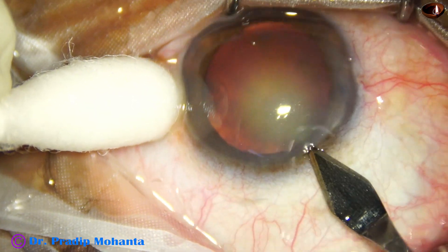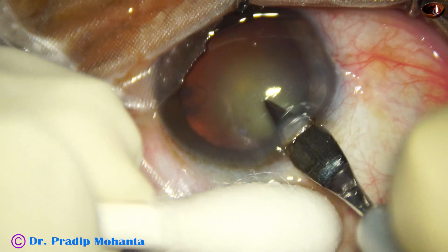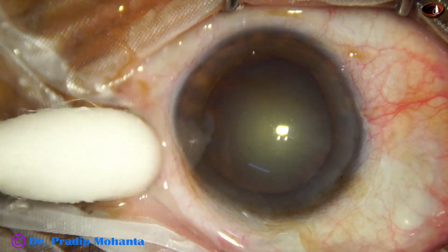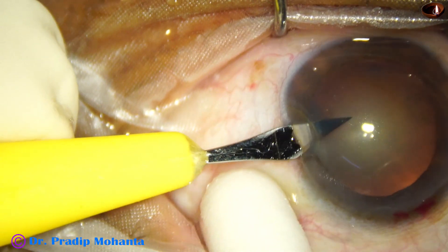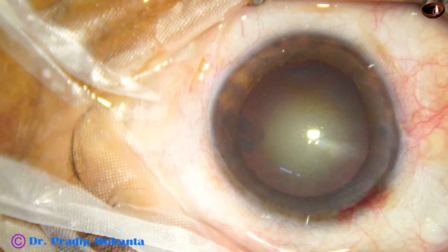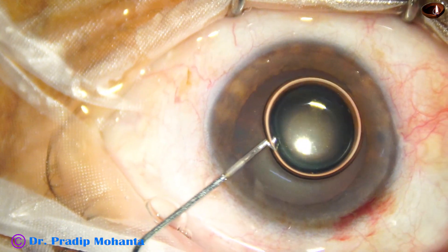This is the main incision with a 2.8 mm steel keratome. A side port is made on the left side of the main incision with a lance tip knife. The side port is 3 o'clock hours away from the main incision.